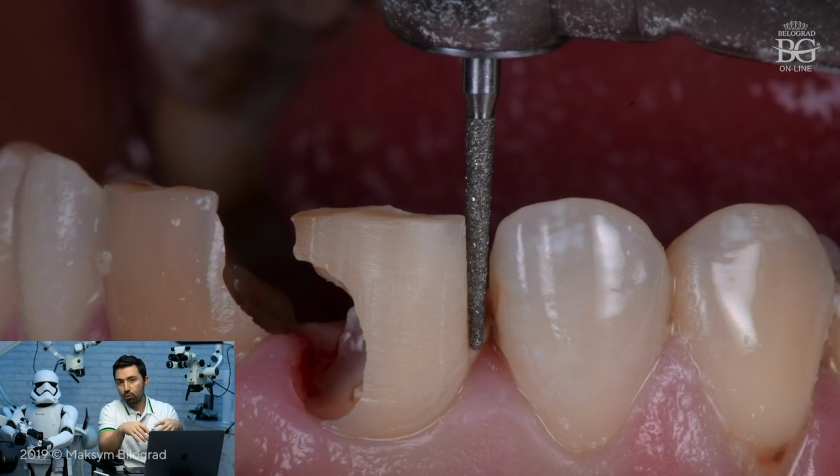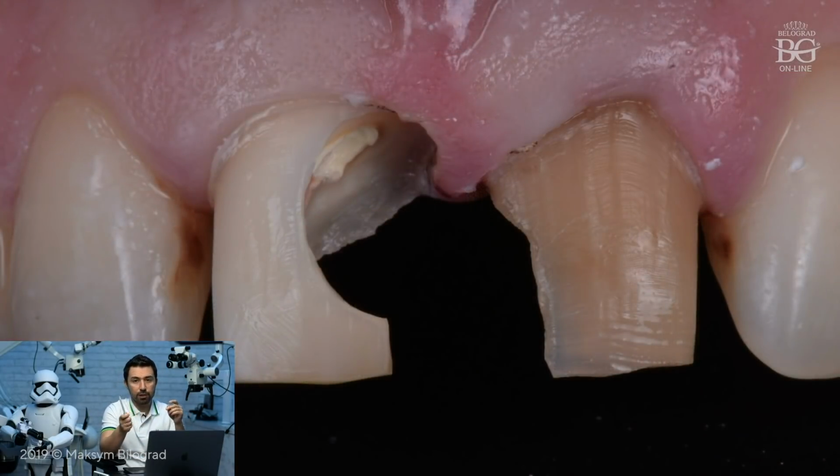Step 1 of preparation was not that difficult. The caries excavation was not that difficult. The most difficult thing here was rubberdam isolation, and to do root canal treatment and to do a proper build-up, we have to do rubberdam isolation in such cases. And there are a few tips and tricks that I would like to share with you in such cases.